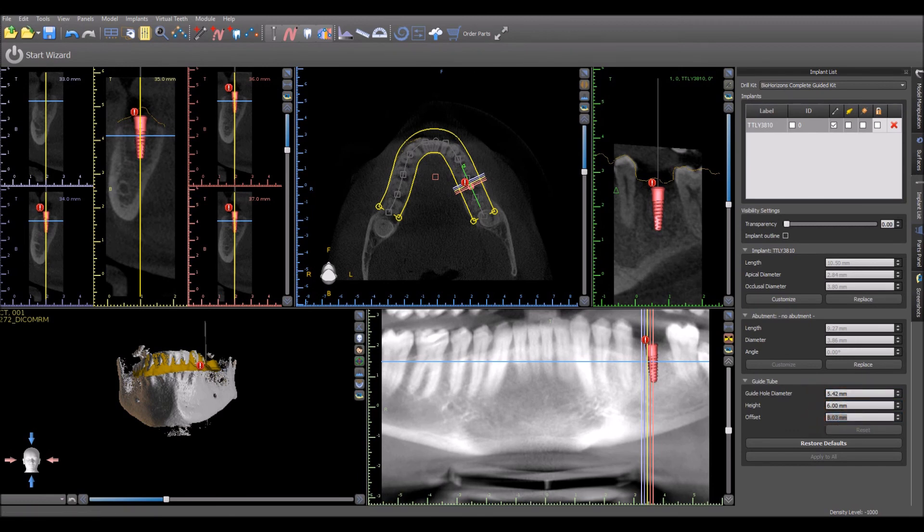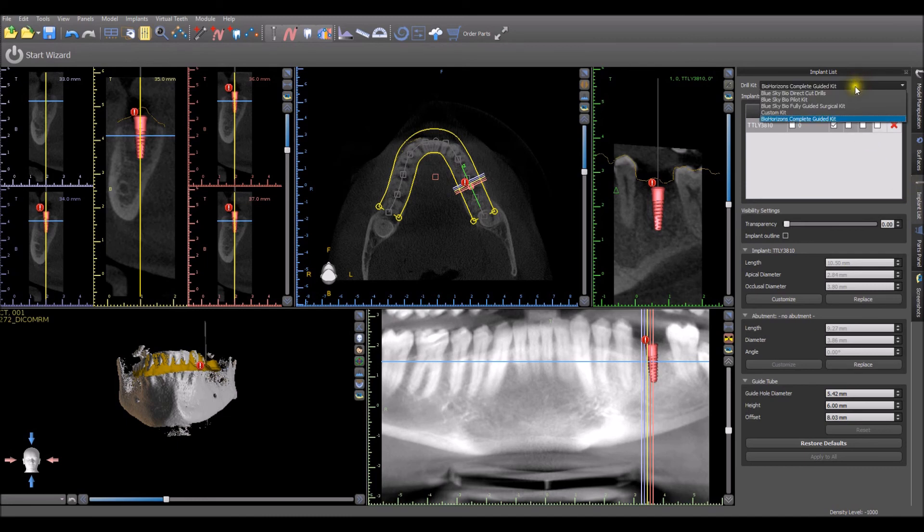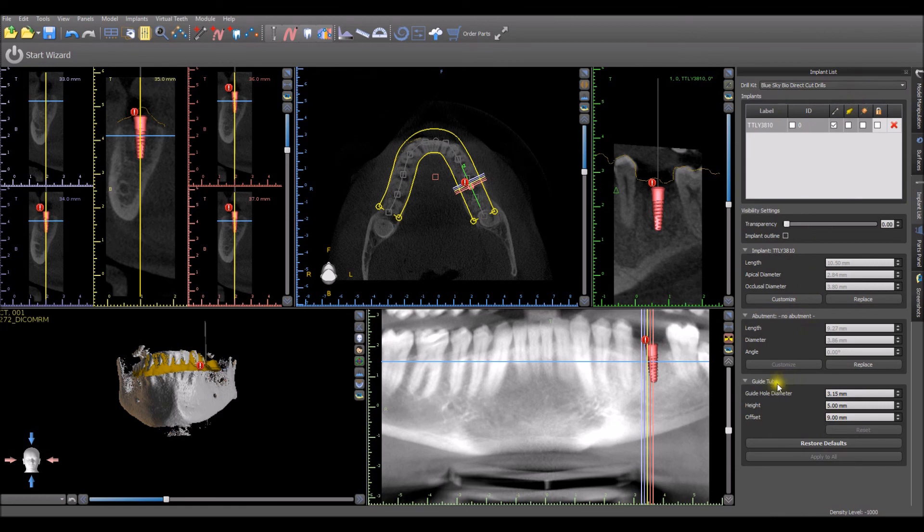To create a built-in drill stop, select the BlueSkyBio direct cut drills and modify the guide tube settings as needed.